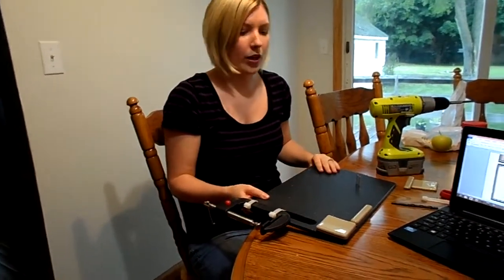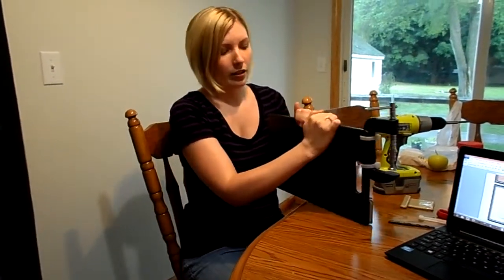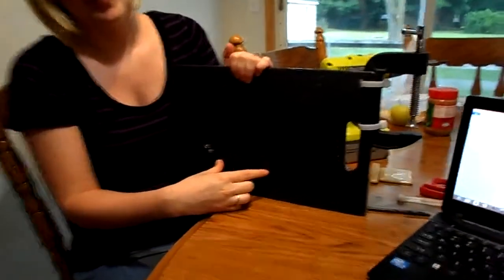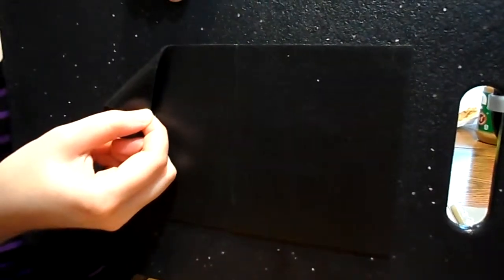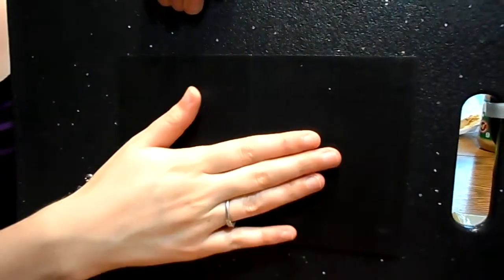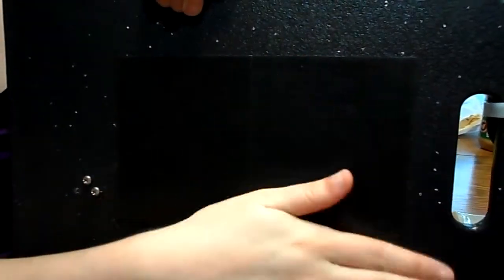The next thing you want to do is make it so the cutting board is a non-slip cutting board. And in order to do that, I have attached these gripper blankets on the base of the cutting board. They came in a package of 2, and all you need to do is go ahead and peel an adhesive backing and stick them down to the back of the cutting board, placing them one right by the other, and that's a very non-skid surface, and so it will hold the cutting board in place.